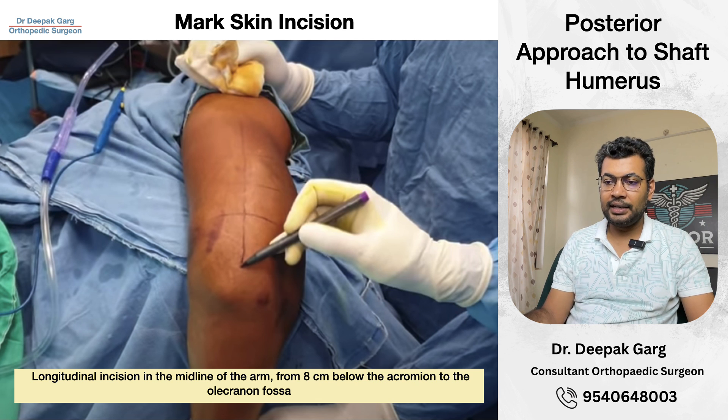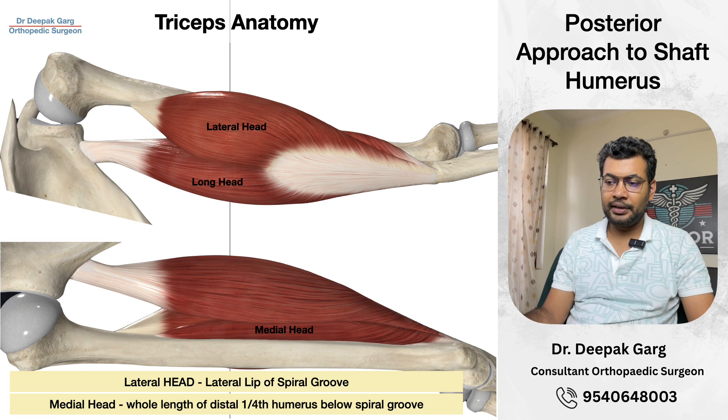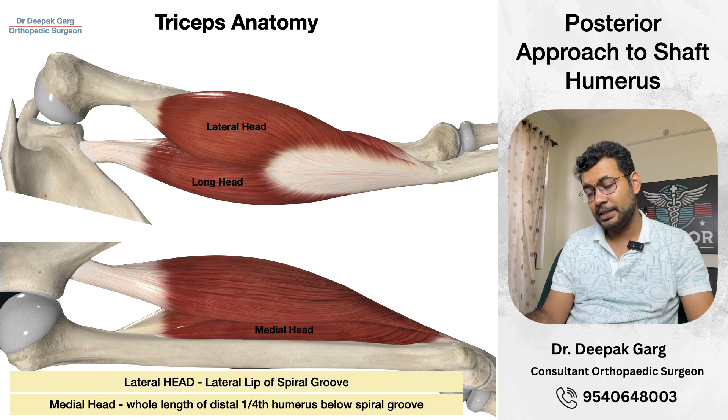We will cut the skin and then we will have the subcutaneous tissue in front of us. Then we will cut the fascia in line with the skin incision. This is a very safe zone. Once we cut it, we need to understand the anatomy. The triceps muscle has three heads: the lateral head, the long head, and the medial head.